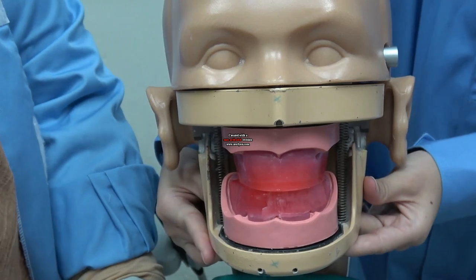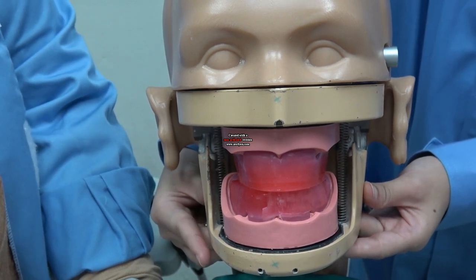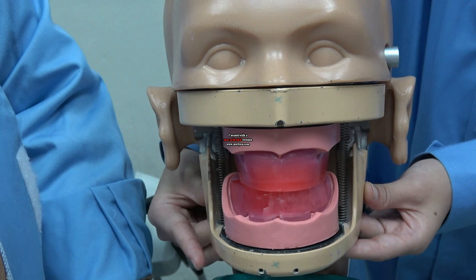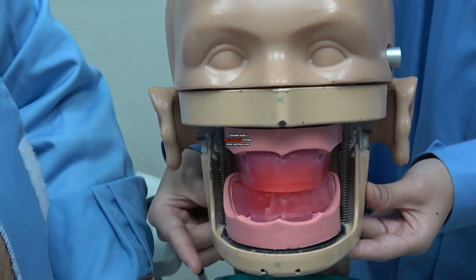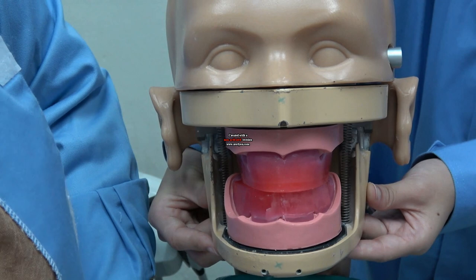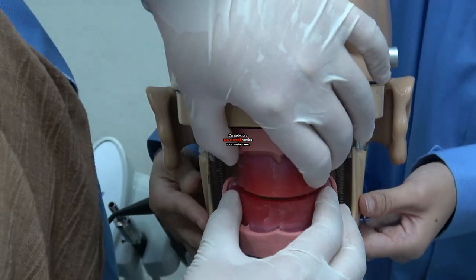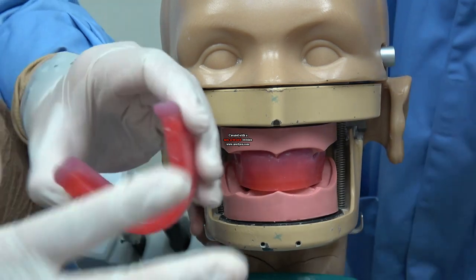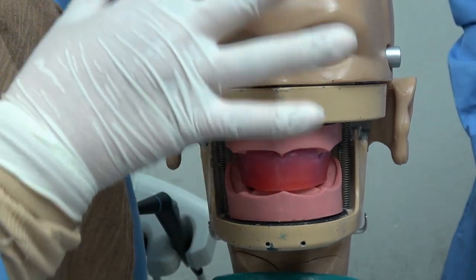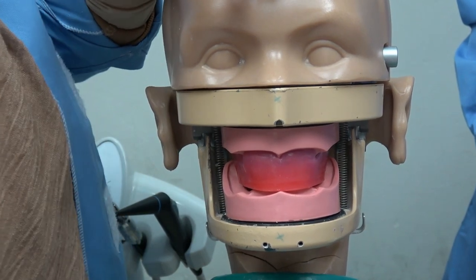Before registration, you must make sure that the freeway space is about 2 to 4 mm. According to the formula, it should be RVD minus VDO, around 2 to 4 mm. Right now we have the RVD as 100 and the VDO as 99, so if you subtract, we just get 1 mm. So we have to trim off the lower rim at least 1 mm so that we get a 2 mm freeway space. If you trim 2 mm, it's still acceptable to get a 3 mm freeway space, but not more than 4 mm.